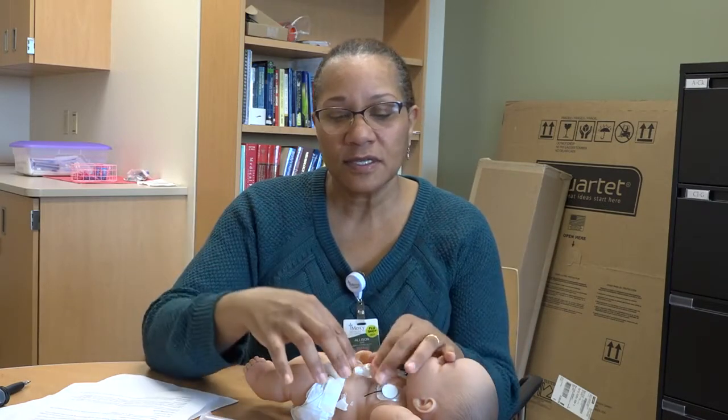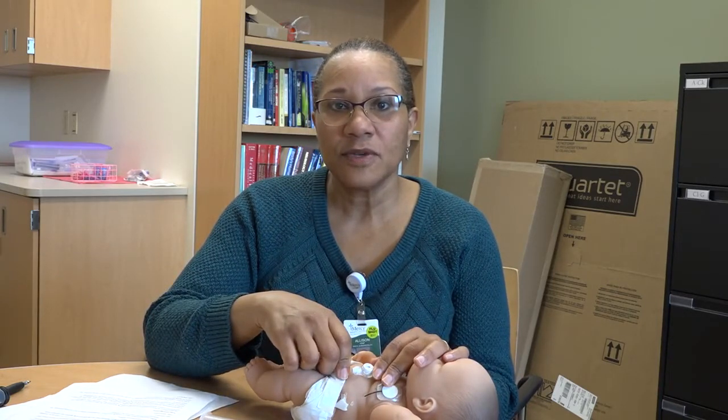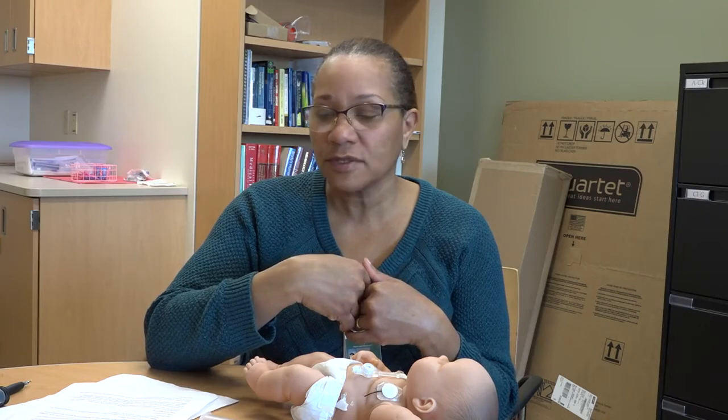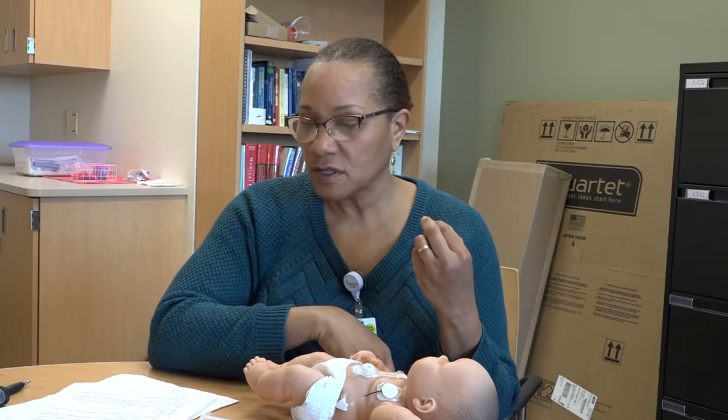We don't want you to use that cream any more than the 14 days because the same reason why it resolves the granulation tissue is by thinning out the skin. If you use it longer than the 14 days, then we can start to damage the skin. So only for 14 days. But hopefully you'll be in contact with the office during this time, and we can check back with you, or you can call us back and let us know what kind of results you're seeing with the use of the triamcinolone cream. So, volume in the balloon, granulation tissue, 2 reasons why you can see more leakage.